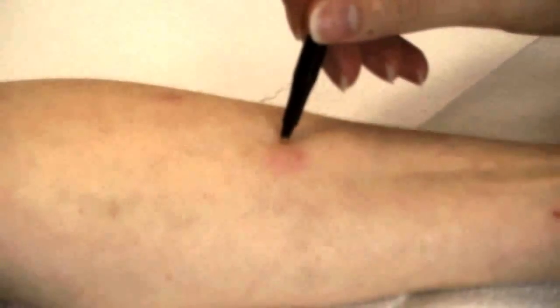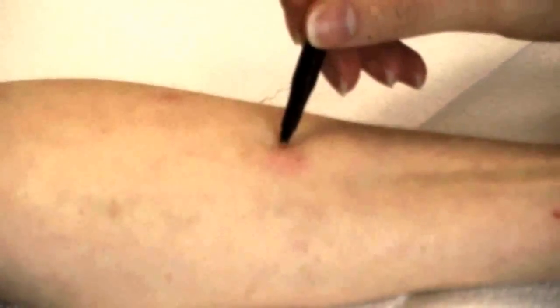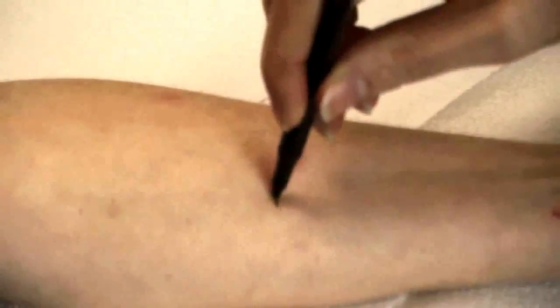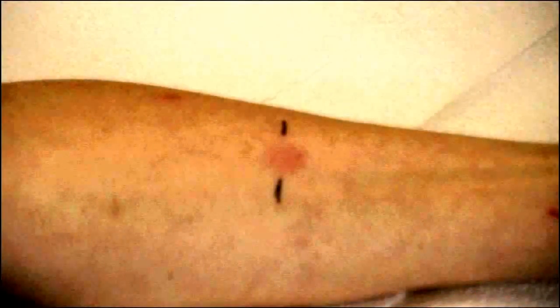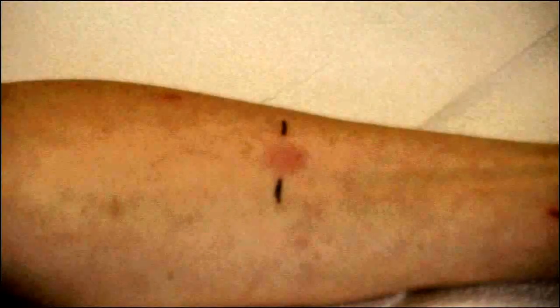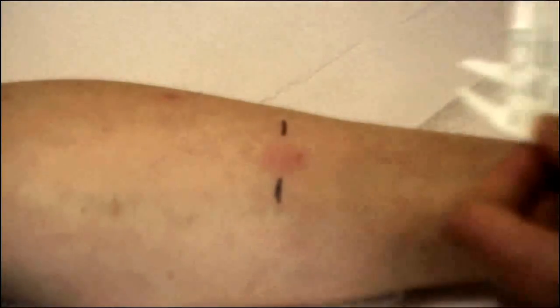The diameter of the induration should be measured across the forearm perpendicular to the axis. Induration is measured by using the tip of a ballpoint pen at a 45 degree angle toward the site of injection. The tip of the pen will stop at the edge of the induration. Measure and document the size of induration in millimetres.